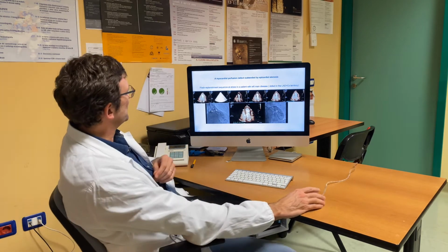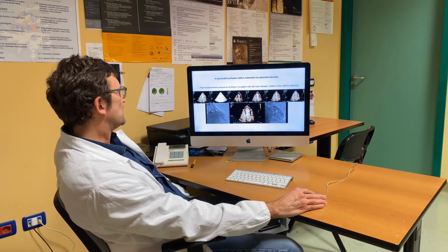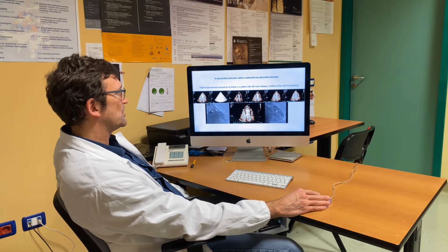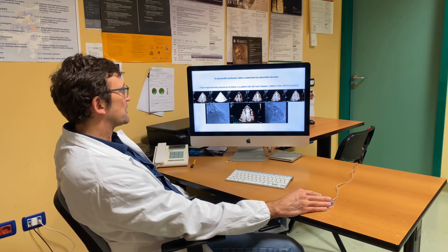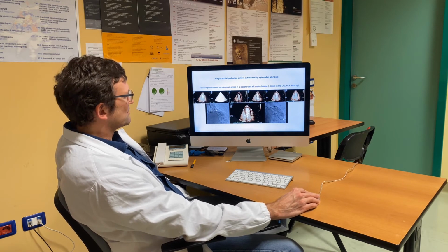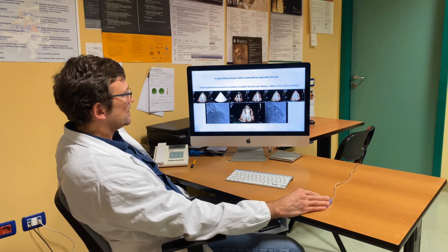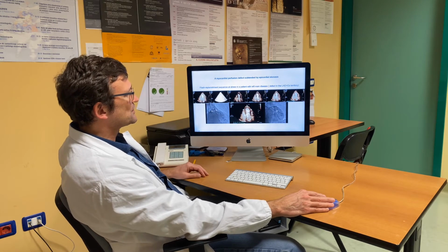So you have, see this please, this is before these impulses are given to the patients, and this is the train of impulses, and after the impulse, you can see that the myocardium, where you have a concentration which is way lower than the cavity, gets completely cleared from the microbubbles, and you can assess. You can see that this is the ECG, the QRS, this is one cycle after the other, and you can see how it replenishes. This is the term you use. So there should be a homogeneous getting back of microbubbles here, or signal.